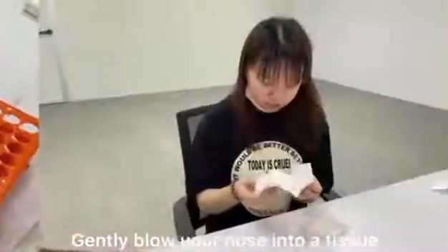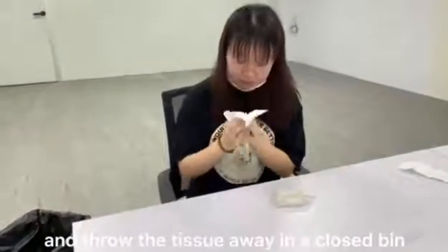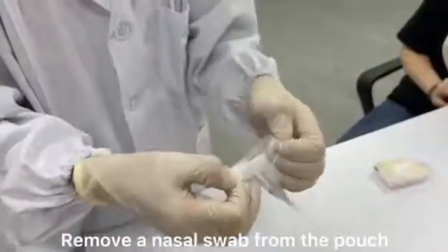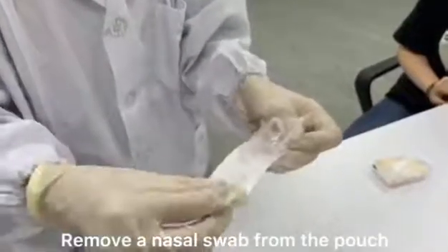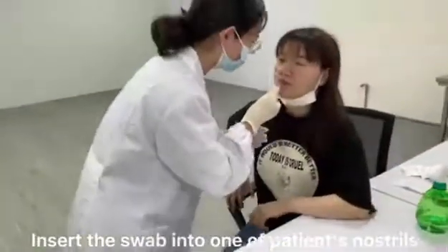Gently blow your nose into a tissue and throw the tissue away in a closed bin. Remove a nasal swab from the pouch.